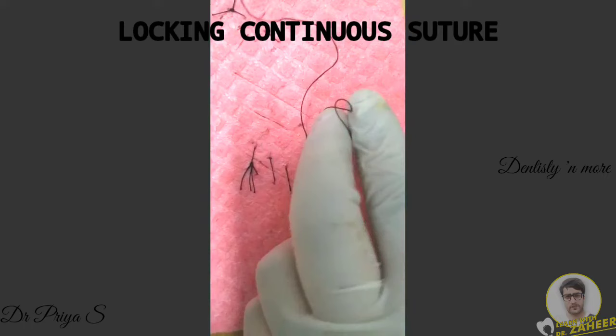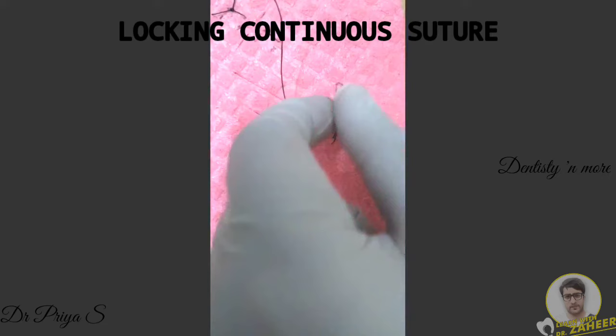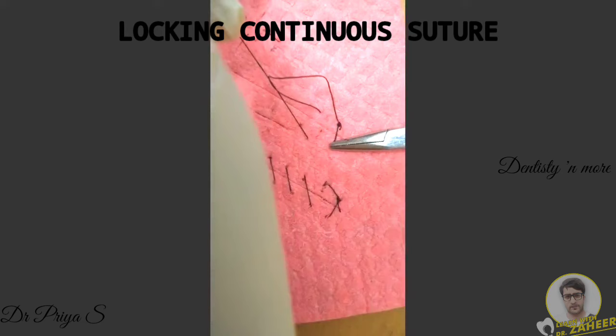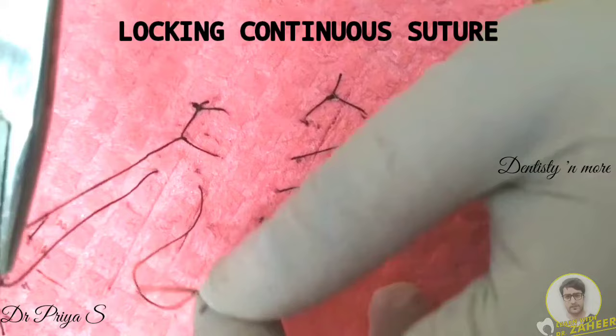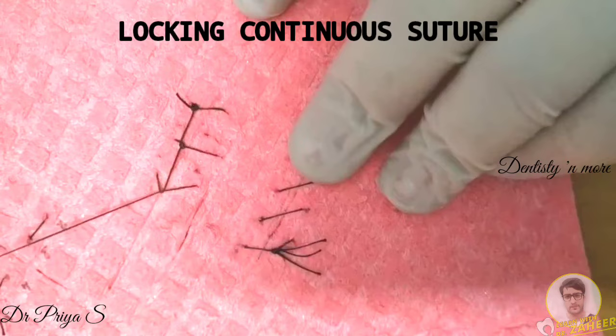After every second bite, as you move the suture material through the skin, make sure it is not passed completely through the skin — leave a loop so that you can pass the needle through the loop before pulling it out completely. I have taken the needle through the loop, which creates a little square in the suture pattern. Pulling the needle out through the loop is the only step that differentiates simple continuous suture from locking continuous suture.